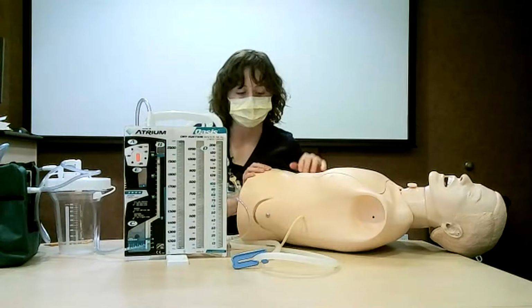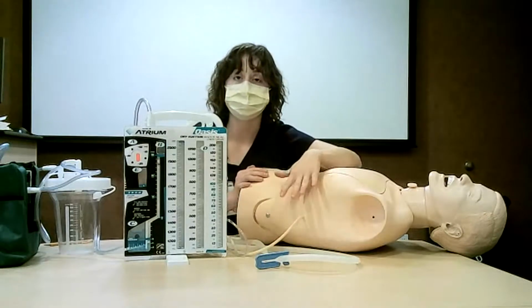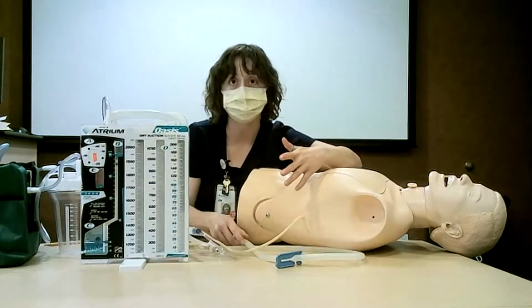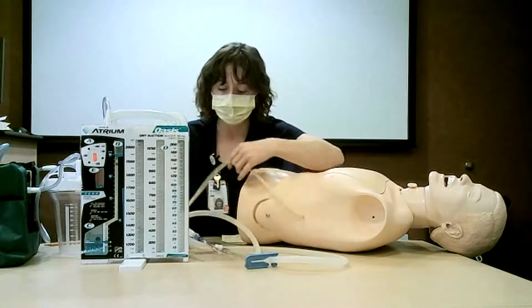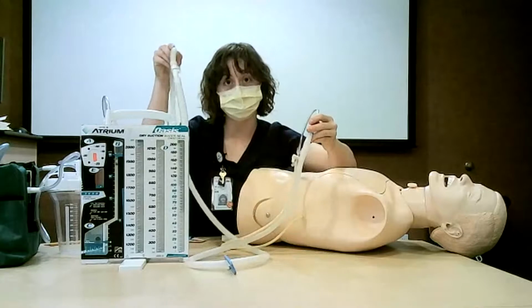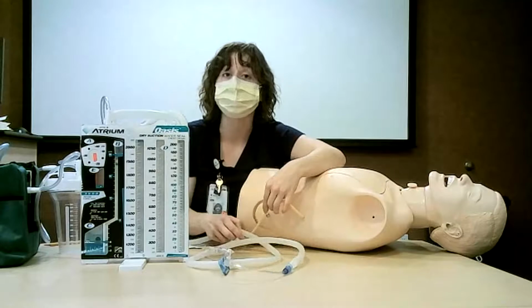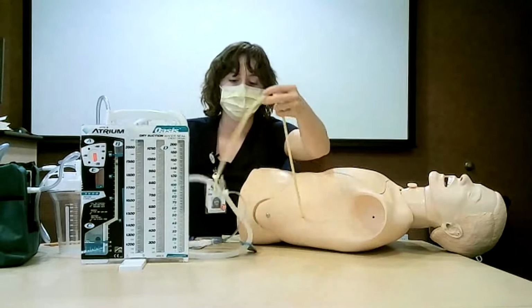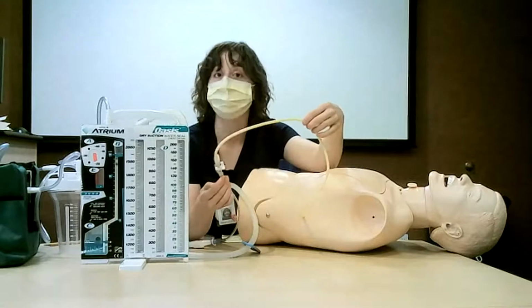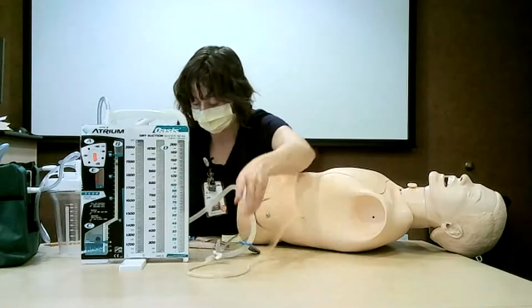Now we want to make sure that the chest tube coming out of the patient is correct as well. You'll want to milk the chest tube with every patient interaction, but at minimum every 2 hours. And that just means draining everything that's in the line directly into the atrium. This also gives you a good opportunity to check and make sure that the tubing isn't kinked. A kink in the chest tube may cause the lung to collapse more than it already is, so we want to make sure that we're assessing that with every patient interaction as well.